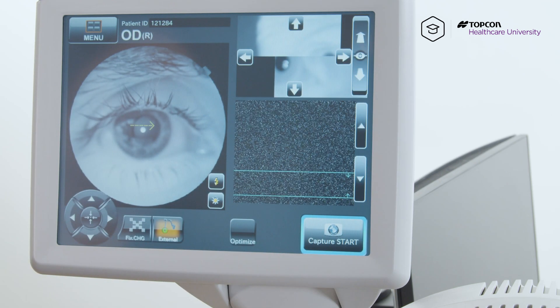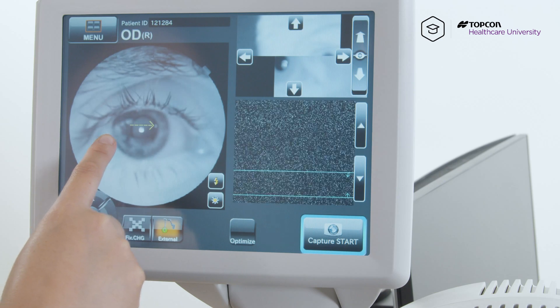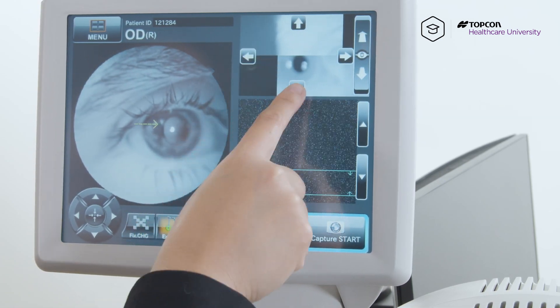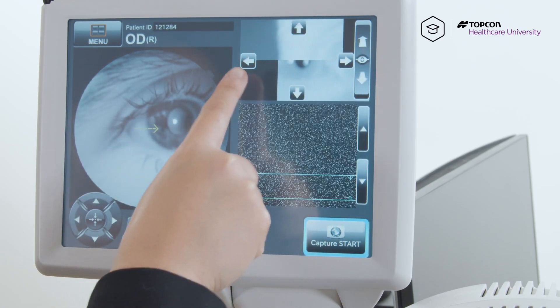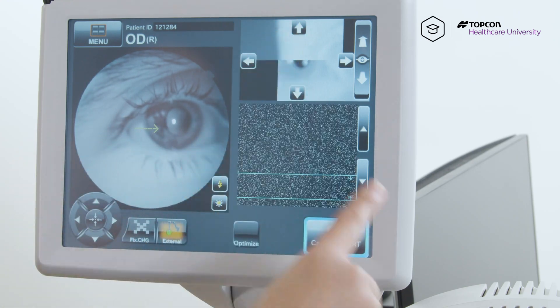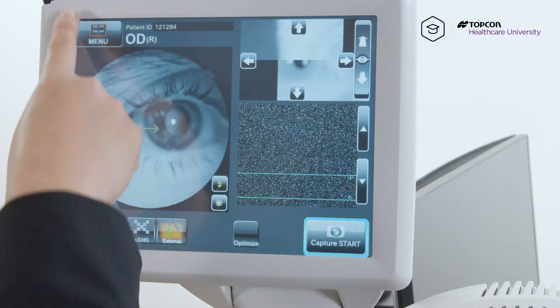Hit capture start, and it brings you to the screen with this green arrow. You want to position that green arrow so that it's being cut in half by the outer edge of the iris. I'm using that by moving the camera with these top right arrows here. We know this is his temporal angle here because his nasal area is here, which is his nose. If we're doing a temporal angle, his temporal side is right here.